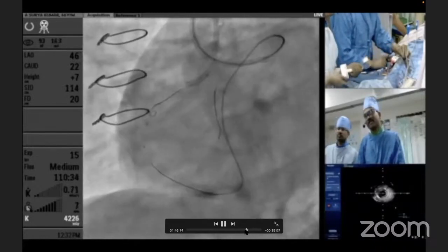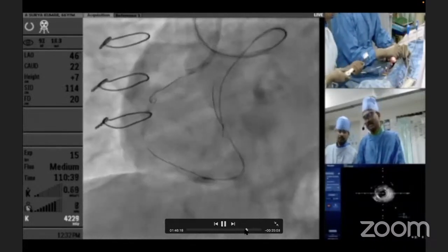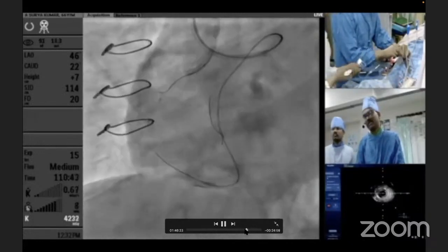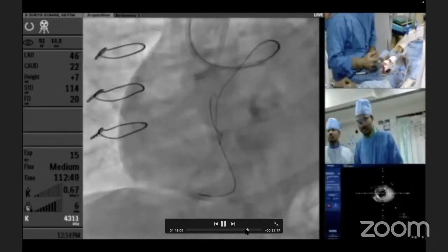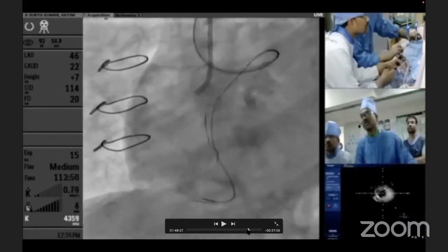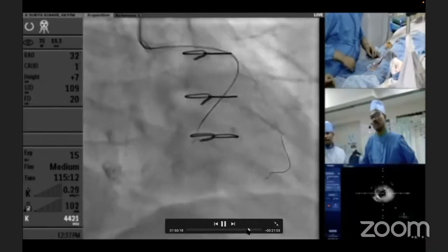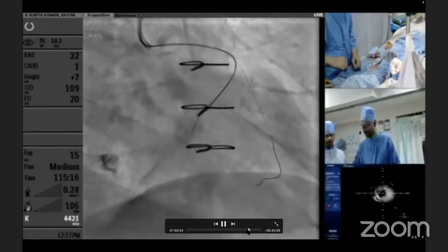So we dilated the entire RCA. And now I pulled my retrograde back. And now comes the question.